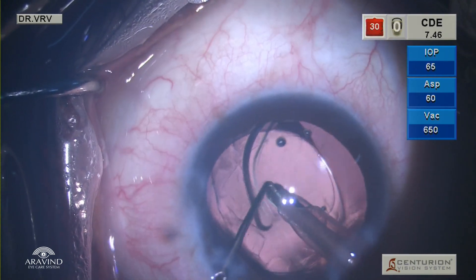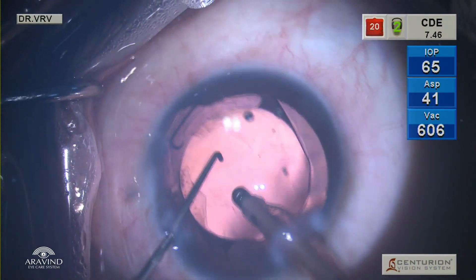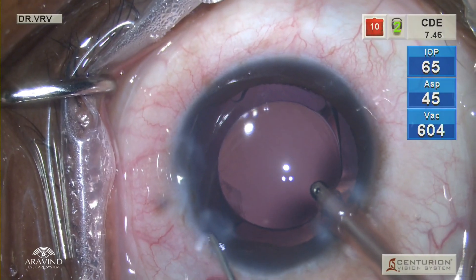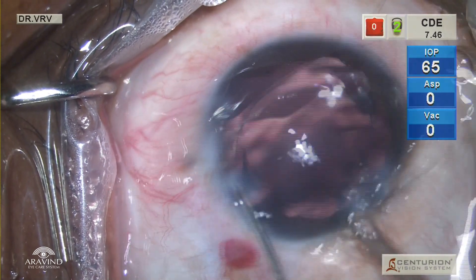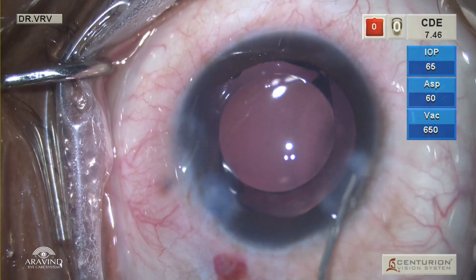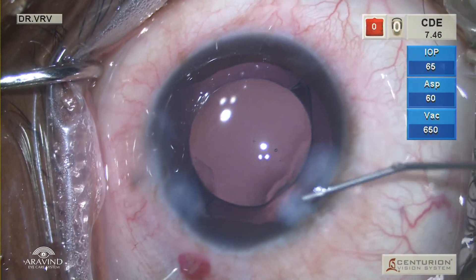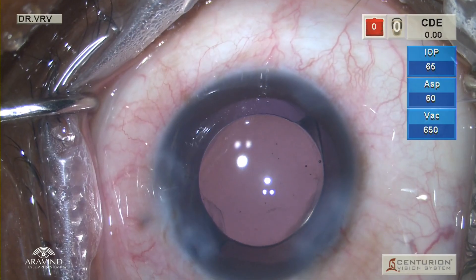Gently, viscoelastic is removed from the anterior chamber and also from within the bag. Before removing the I&A probe from the eye, the secondary incision on the left side is hydrated using BSS and hydrocannula, and gently the probe is withdrawn in order to prevent sudden collapse of the anterior chamber. All the incisions are then hydrated and intracameral moxifloxacin is injected.